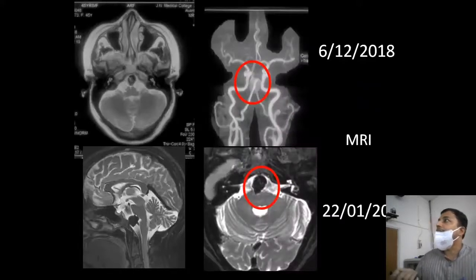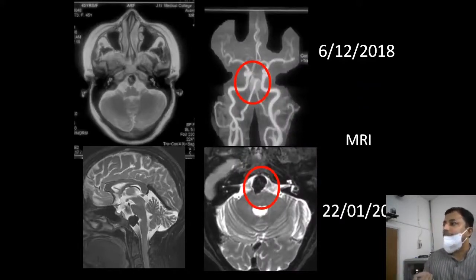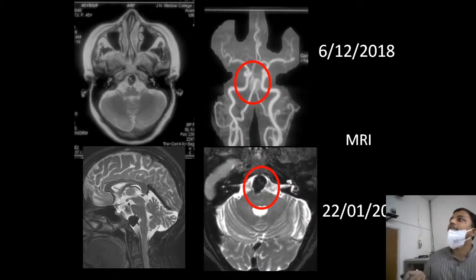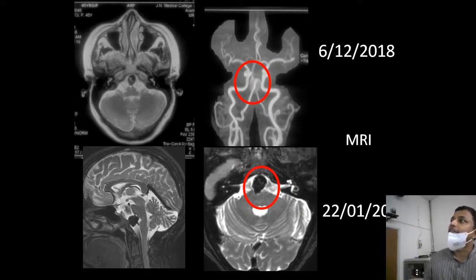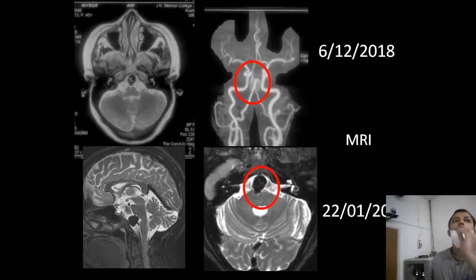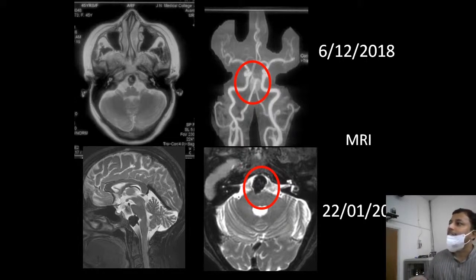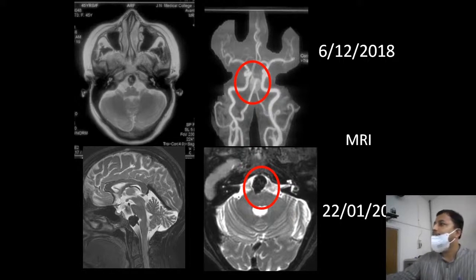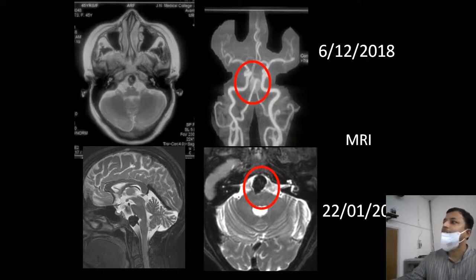These are the MRI images she was carrying, and we also performed MRI at AIMS. On axial T2 sections at the level of the medulla, we can see a T2 hypointense lesion in front of the medulla — this is called a flow void, located exactly at the position of the basilar artery, indicating an aneurysm. On sagittal images, it is causing mass effect at the pontomedullary junction. The aneurysm is completely patent with no thrombosis.